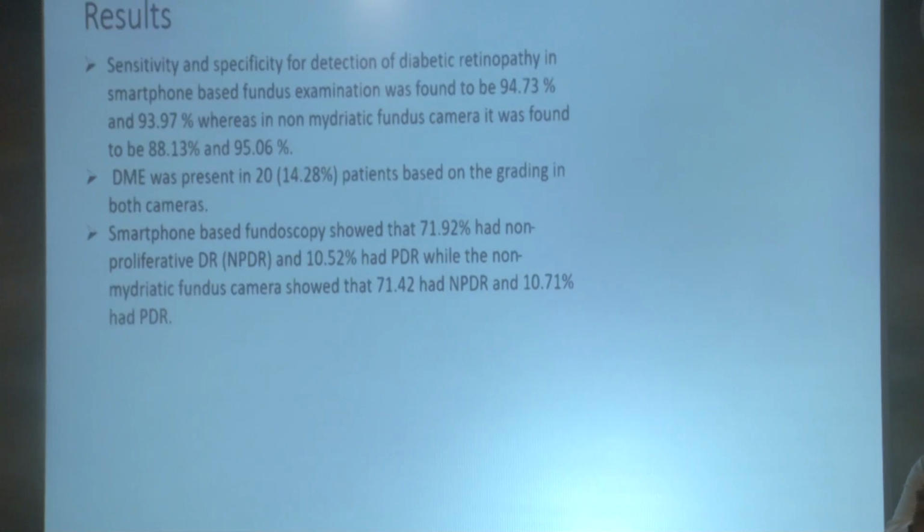Results: sensitivity and specificity for detection of diabetic retinopathy in smartphone-based fundus examination was found to be 94.73% and 93.97%, whereas in the non-mydriatic fundus camera it was found to be 88.13% and 95.06%. Diabetic macular edema was present in 20 patients based on the grading in both cameras.